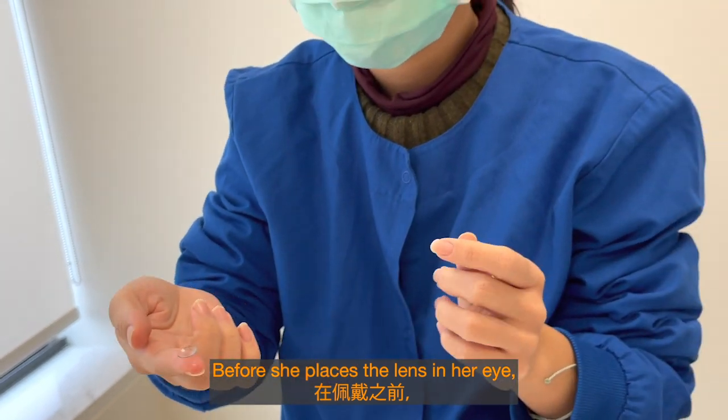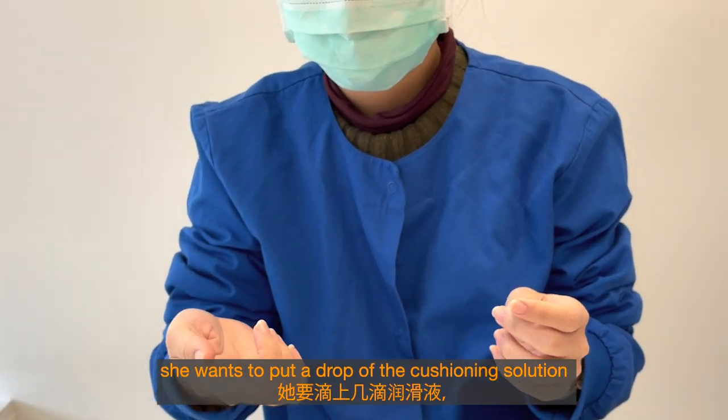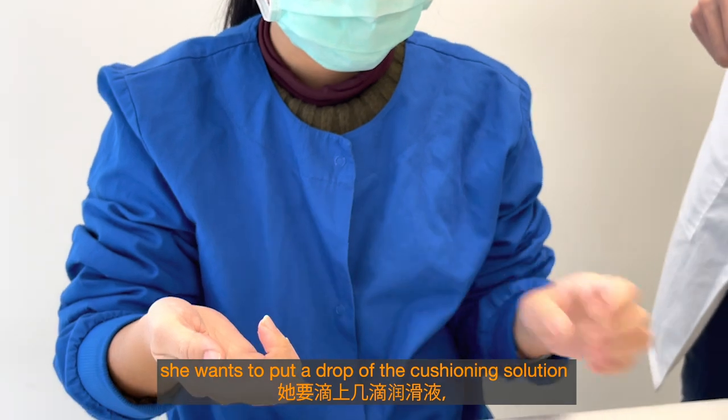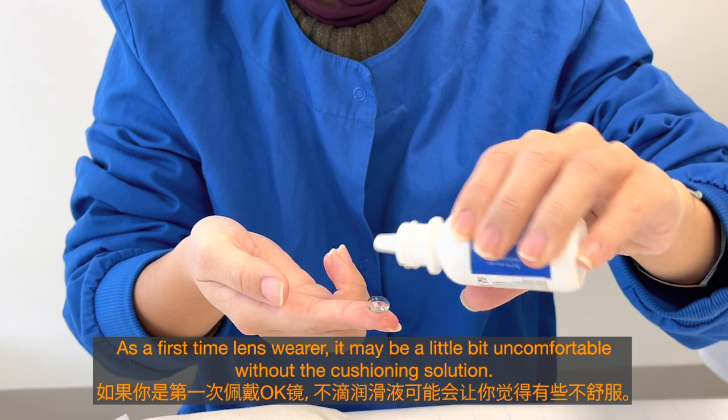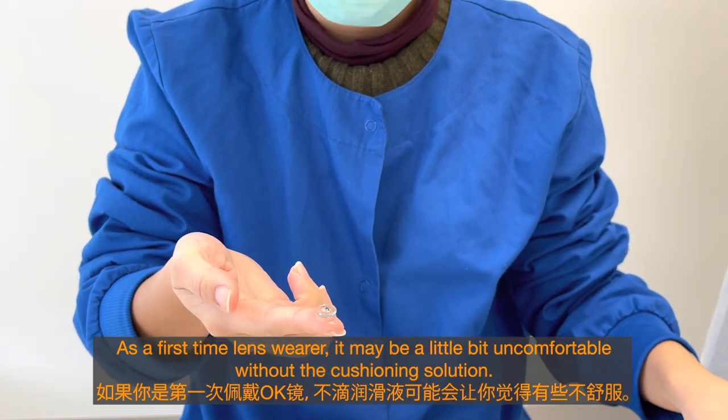Before she places the lens in her eye, she wants to put a drop of the cushioning solution so that it feels more comfortable on the eye. As a first-time lens wearer, it may be a little uncomfortable without the cushioning solution.